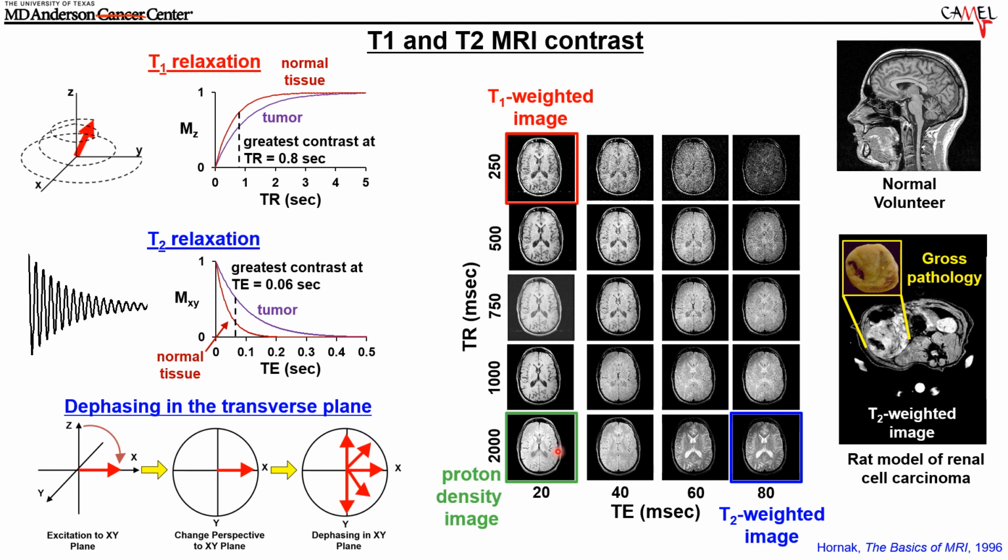The contrast is really when I have either a lot of T1 weighting, with a short TR and then a short TE, or I have a long TR and a long TE, dictating T2 weighted contrast. And here you can see that the liquid-like cerebral spinal fluid compartments are very bright relative to the more solid-like gray and white matter within the brain. Here the gray and white matter looks bright while the cerebral spinal fluid looks dark because it has not returned to equilibrium very fast.